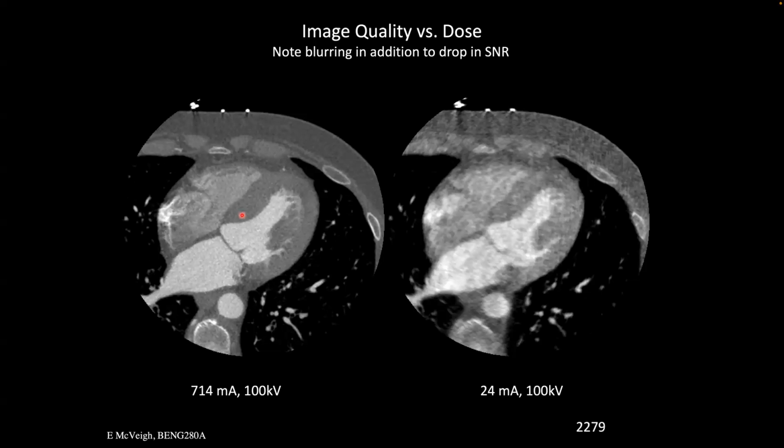Usually manufacturers make a lot of guaranteed income by having a service contract on every device they sell. And so you put a scanner in and you pay literally up to 10% a year of the full price of the scanner to have a full service contract. And that means if anything goes wrong, they just replace it, right?